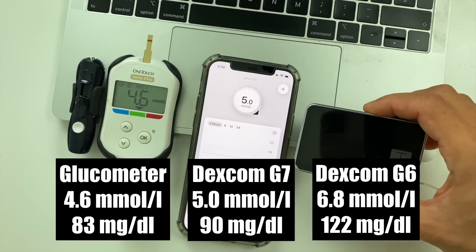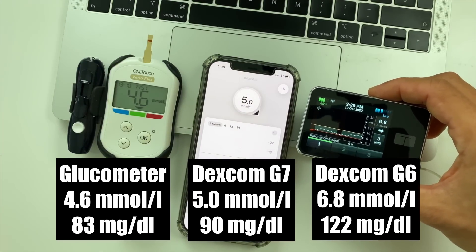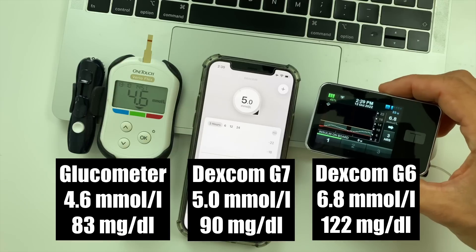The warm-up on my first G7 sensor just ended and I'm already getting readings in my G7 app — so exciting, I've been waiting for this for years. The G7 shows 5.0, the G6 shows 6.8, and my glucometer says 4.6 — all in millimoles per liter. I'll put the numbers in milligrams per deciliter on the screen. That's quite a difference, so let's talk about accuracy next.